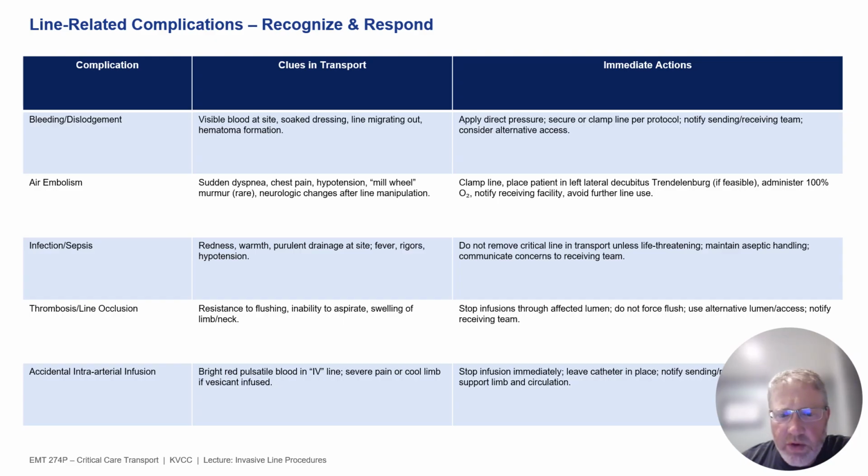Never remove a critical line while en route unless it's actually life threatening. And if you have to, always maintain aseptic handling and always have a direct line with the receiving team at the hospital you're going to so that they know what they're getting.